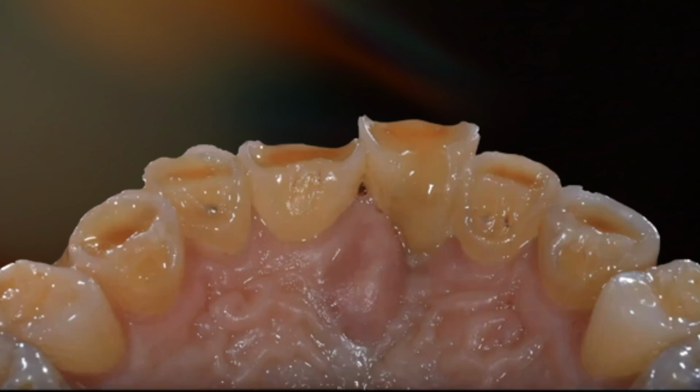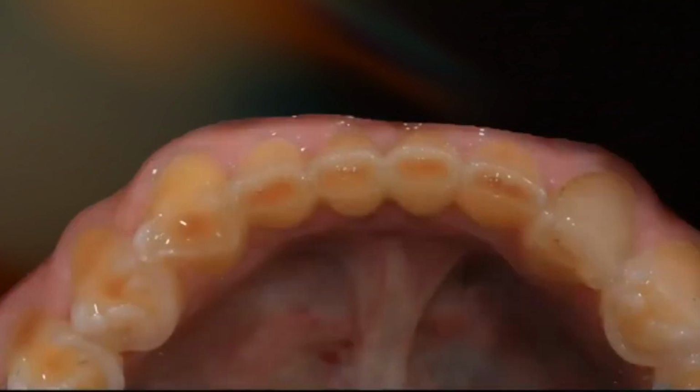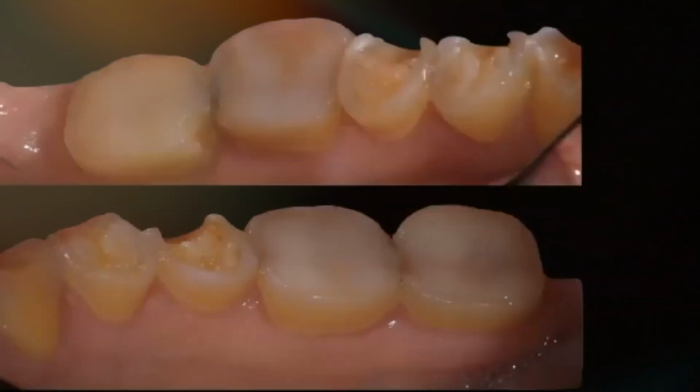So we decided to make 3 to 4 partial tabletops for the posteriors and veneers for the anterior teeth. Occlusal view for the lower anteriors and the posteriors. A lot of composites, fractures, erosions. So we decided not to touch the lingual surface, but to work on the occlusal, mesial, distal and facial surfaces, which had the most erosions.